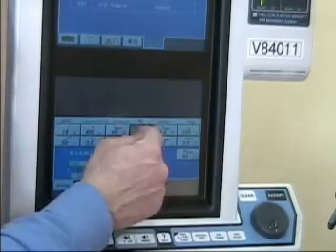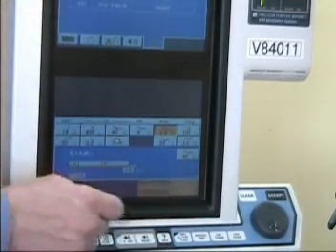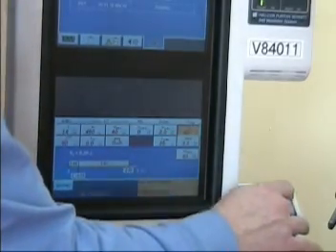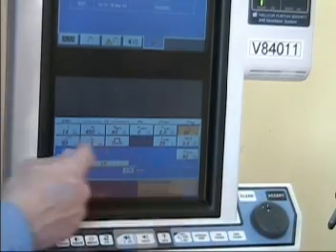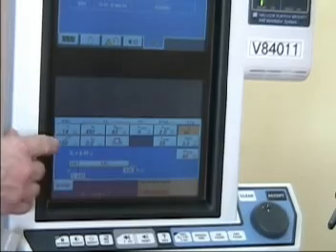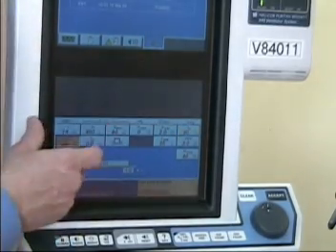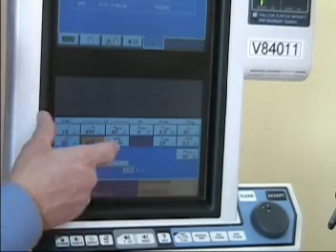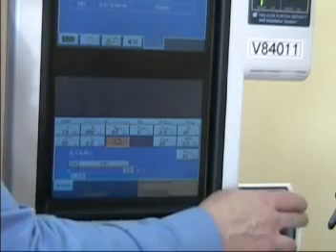we want a medium flow of 40. Pressure support — we'll go with none at this time. Pressure sensitivity, negative 2 is most typical. FiO2, we'll start with 80%. Going back here, this is the rise time percent — we'll leave it at 50%. TPL is plateau time — we'll leave that at zero. Square wave or ramp — we'll stay with square wave.